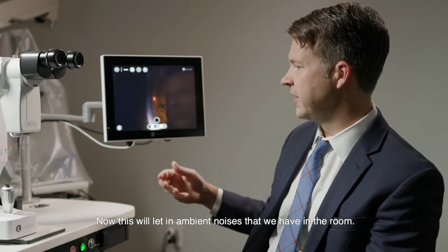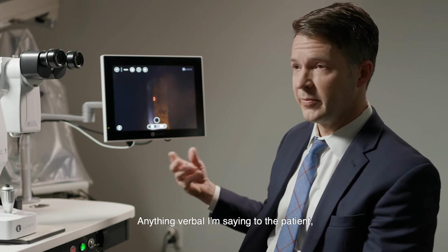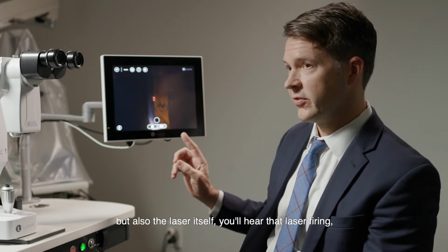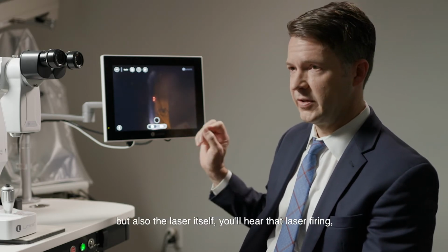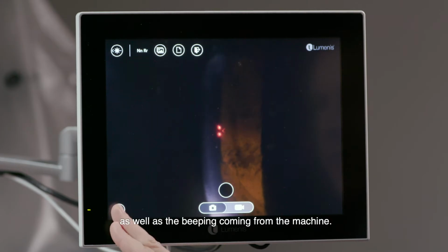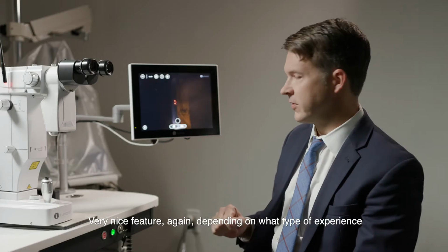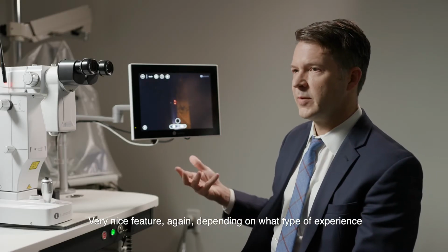Now this will let in ambient noises that we have in the room, anything verbal I'm saying to the patient, but also the laser itself. You'll hear that laser firing as well as the beeping coming from the machine. And if we don't want that, we can simply mute that out. Very nice feature.